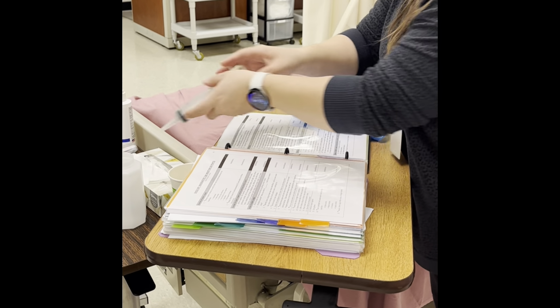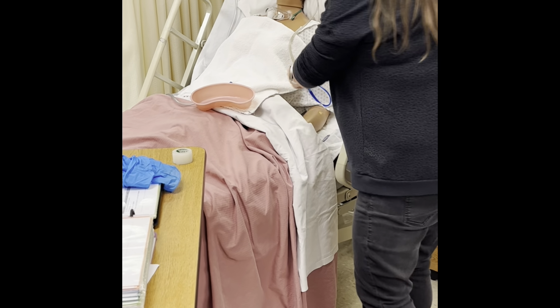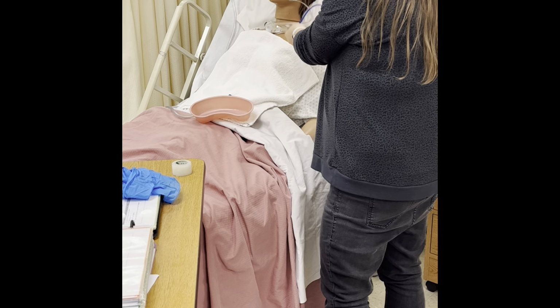Once we've done that, normally these are water containers. We would take 20 cc's of water and we want to flush the tube. That's really all I was telling you. We would just take this off, put this on, put the water in, and then reconnect the tube for now.